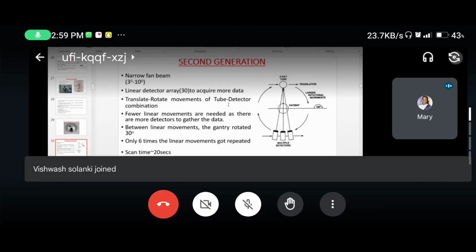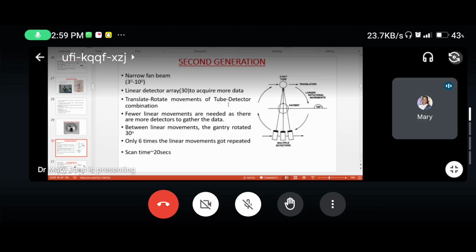When X-ray is falling, that starts acting on the surface of the skin. So the X-ray starts getting attenuated. So that is what is giving us the information. So when bolus is placed, bolus is something of tissue density. So if something of tissue density is placed over the surface, then the X-rays will start attenuating where the outer part of the bolus is there.